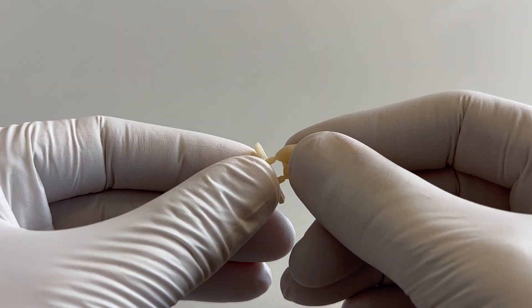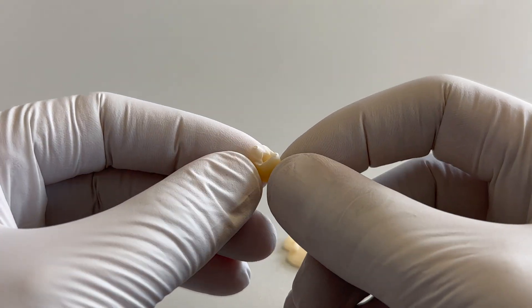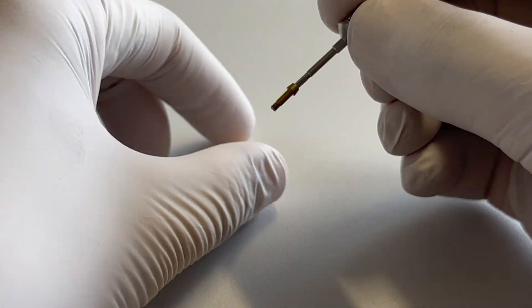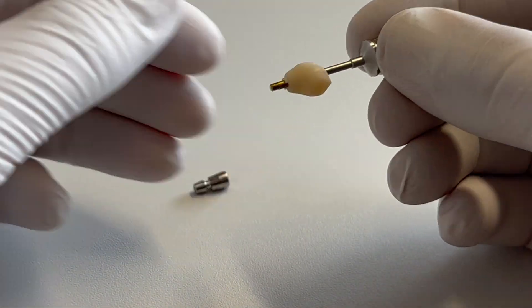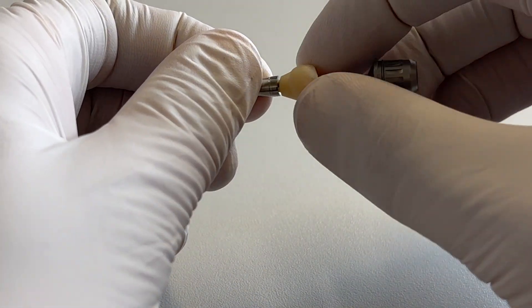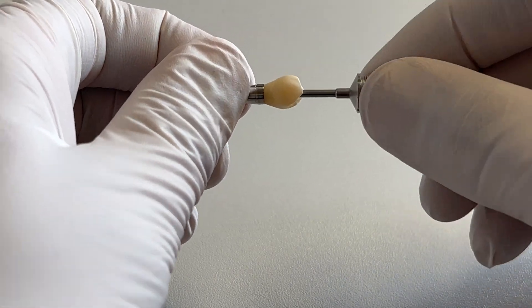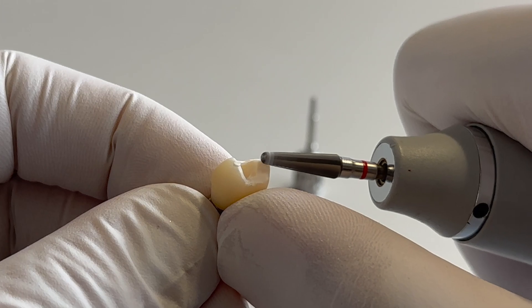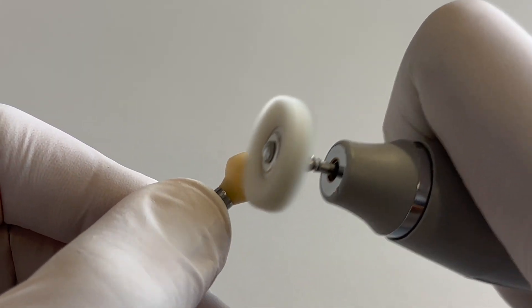Carefully cut or break off the supports. It is important to protect the matrix connection throughout the finishing process by screwing the prosthetic into an implant analog. Grind, polish and finish the prosthetic with standard dental tools.